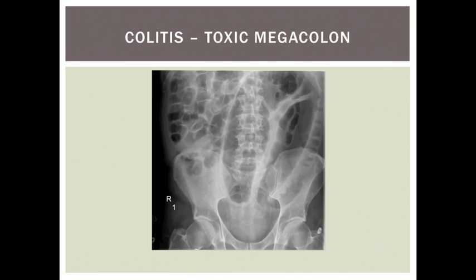This is an x-ray that gastroenterologists fear to see, as it means that medical treatment for colitis has failed. In this x-ray you can see that the whole sigmoid colon is distended to a width of over 6 cm, which is the cut-off for diagnosing toxic megacolon. The sigmoid colon appears as an upside-down U shape, and you can then see the descending colon on the patient's left with a very thick colonic wall. The surgeons need to be contacted urgently as this patient almost certainly requires an urgent total colectomy.